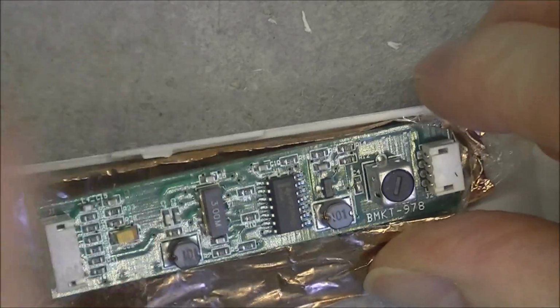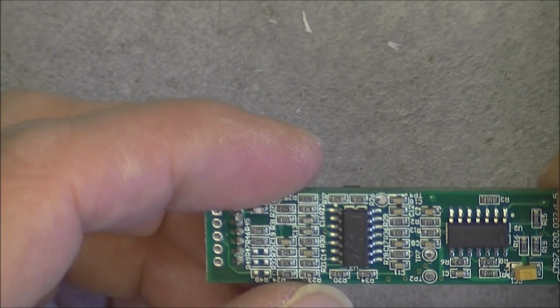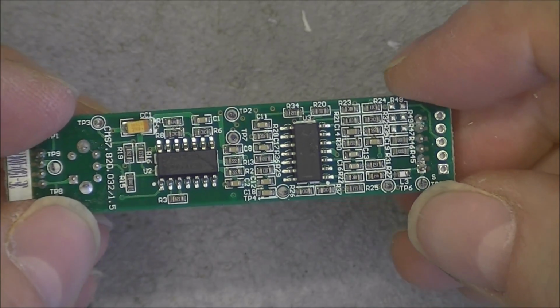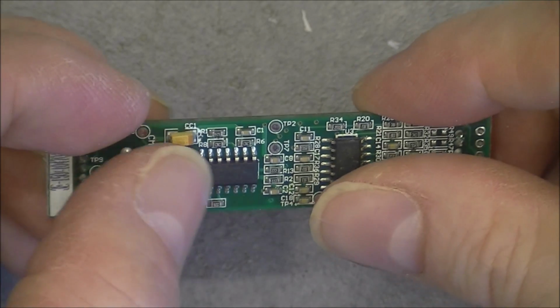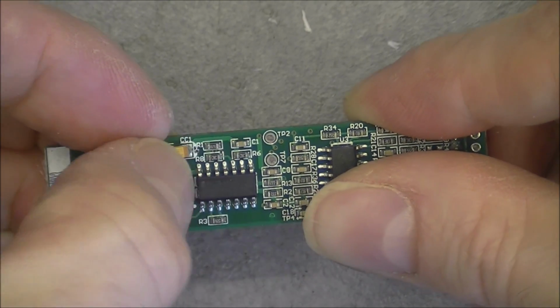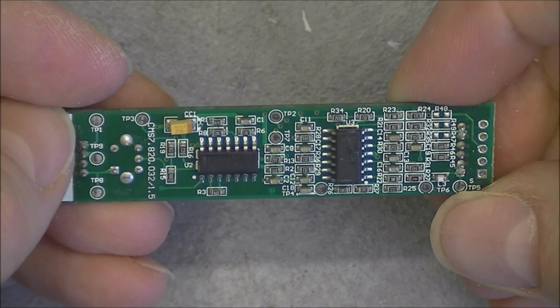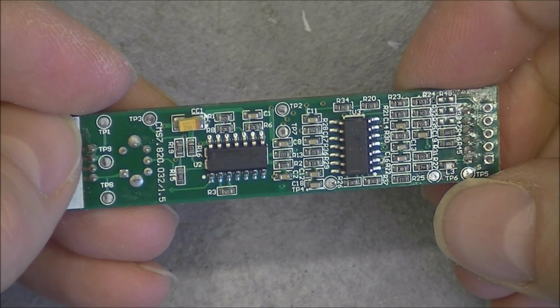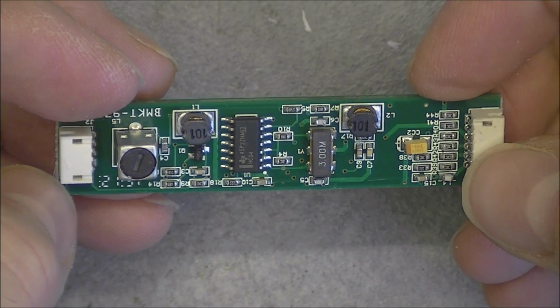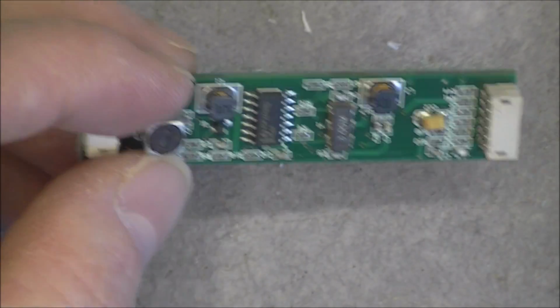In fact, yes. We have more stuff on the back, but here the IC numbers are just not easy at all to read. On this one I see nothing, and on this one very difficult also. One little tantalum cap and a few little resistors and capacitors. So this seems to be a completely analog thing. Well, I don't know in fact.